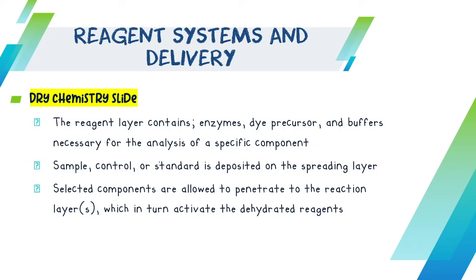I forgot also to emphasize that between your liquid and dry reagent, it would always be best to have a dry reagent. Why? Number one, it lasts longer, it is preserved longer. Because if it is reconstituted already, or your liquid reagent, it gets damaged more easily. Unlike your dry reagent, which is in powder form and not yet used, so it has a longer shelf life. I forgot to point out that one.